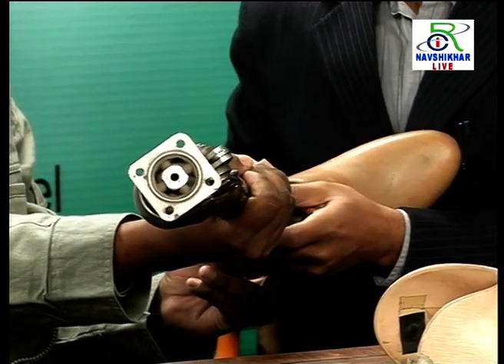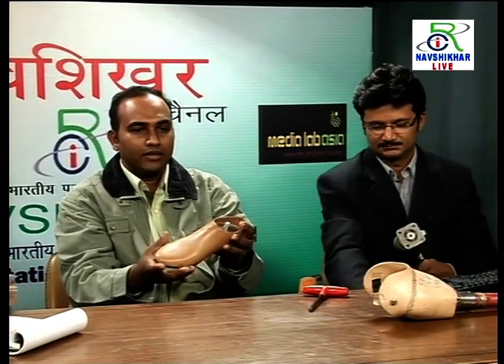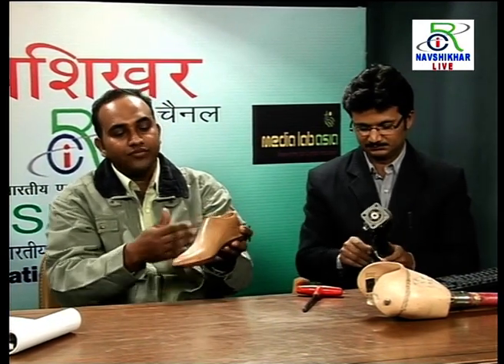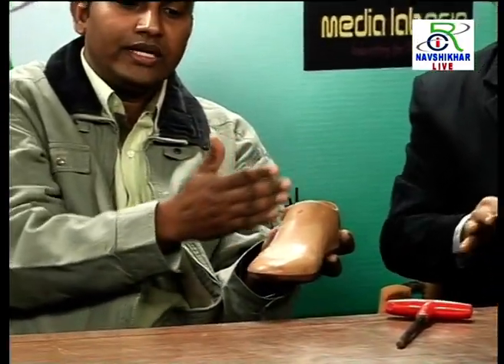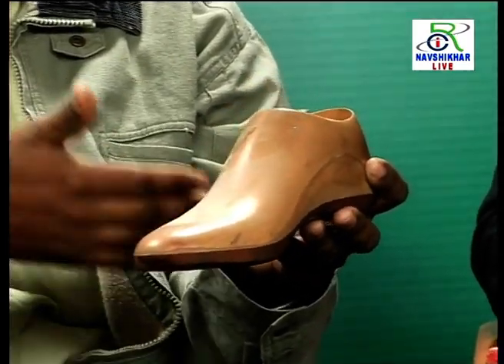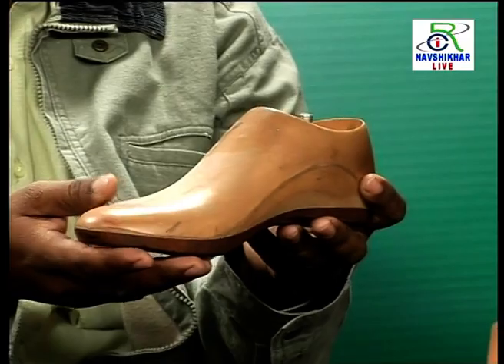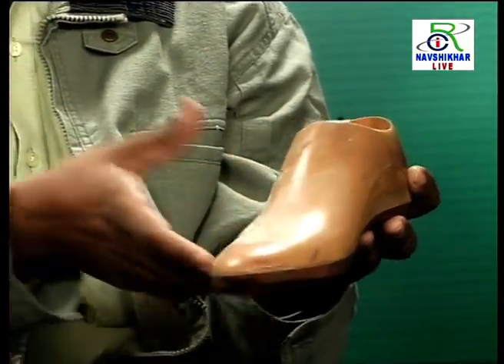But in the integrated system, we have to throw away the pre-existing limb and then make the limb again. Like this foot, if the patient wants to change it, if it breaks down or something happens to it, it can be changed. If the patient wants to upgrade the foot, because feet have been researched for the last 20 years and a lot of new feet are coming out, like high activity feet in the market, he can change it if he wants to. After 1 year of use, if he wants to upgrade, he can change the foot. He doesn't have to change the whole limb. So this is the advantage of the modular system.